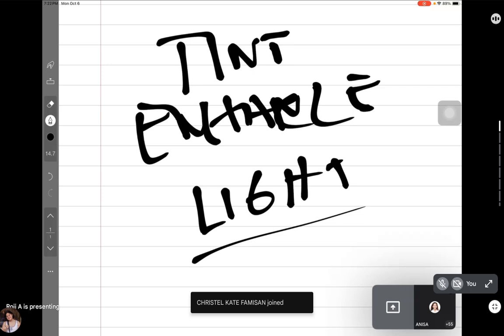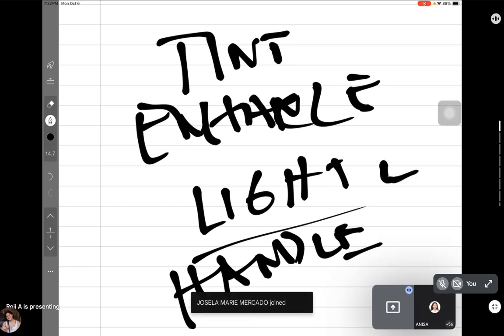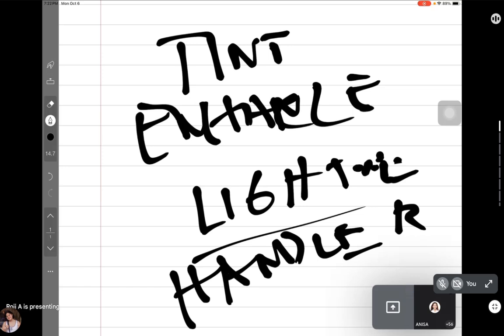Totoo. But there is also what you call handling tint. Pag sinabi mong handling tint, yung contact lens has a color so that you can differentiate left from right. Yung left gawin nating yellow. Why? May L dun eh. Hindi mo makakalimutan. Yung right gawin kong red.